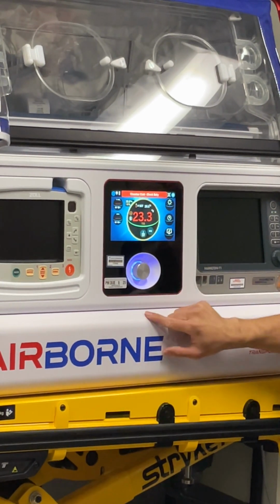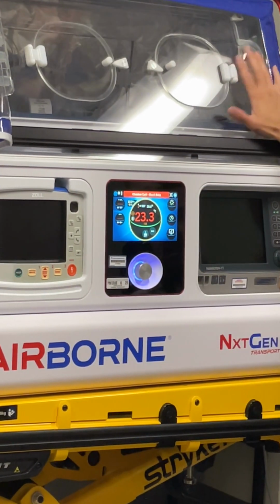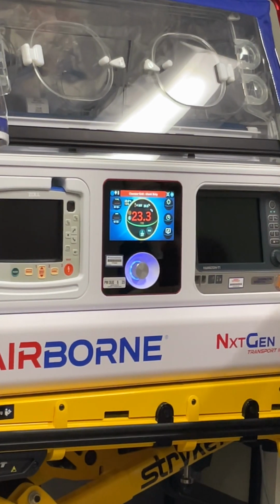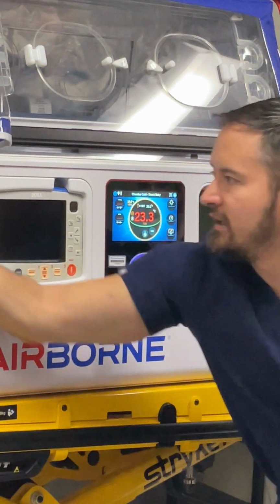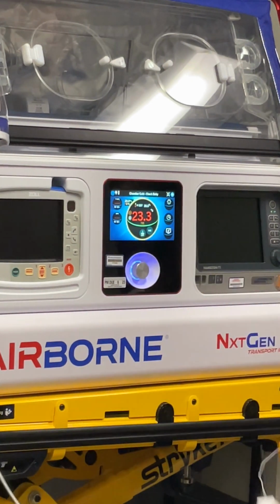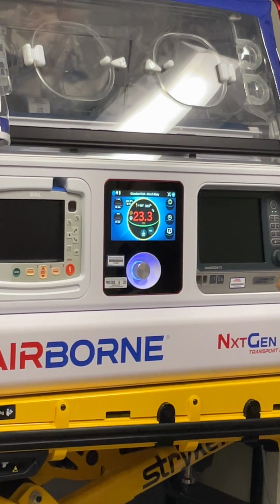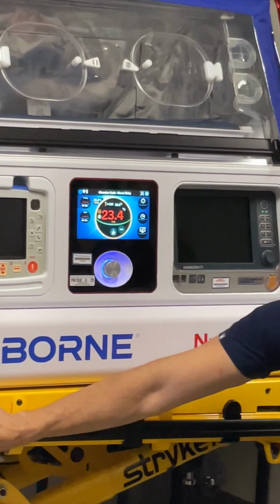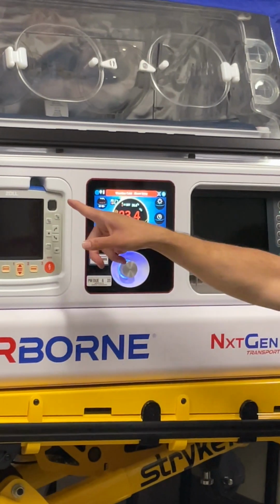So when we pop this on, there's our main. Right now it's just heating the chamber. It has no patient feedback currently. But now that the probe is hooked up, it's at least giving you the number. So right now this probe is what that number is in that top left corner. This would be if you had the SpO2 hooked up on that side monitor.